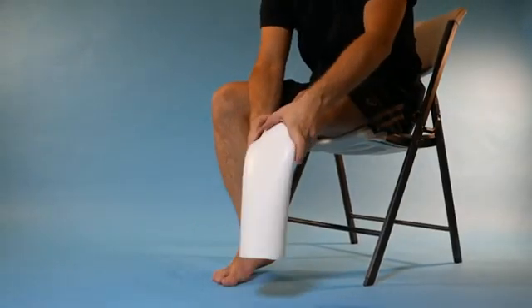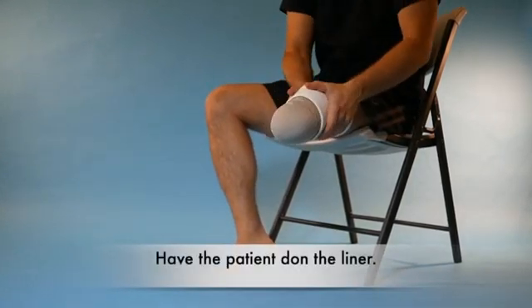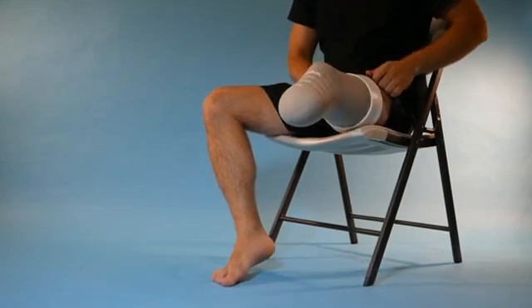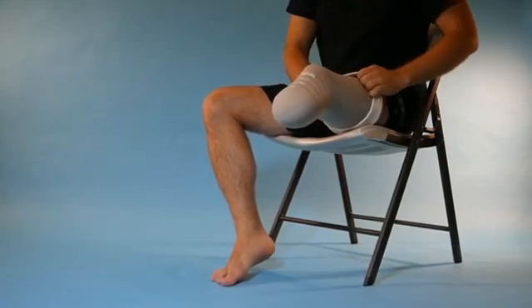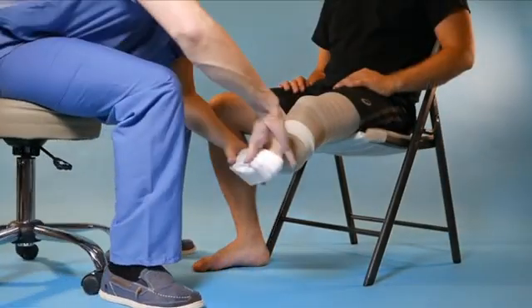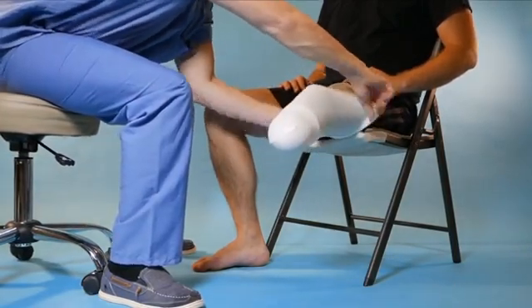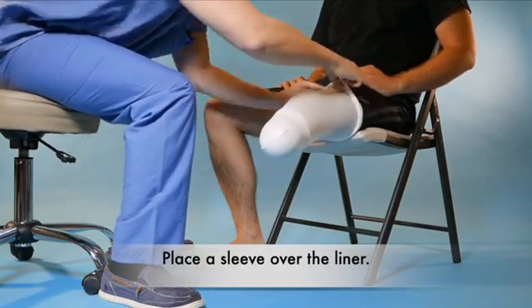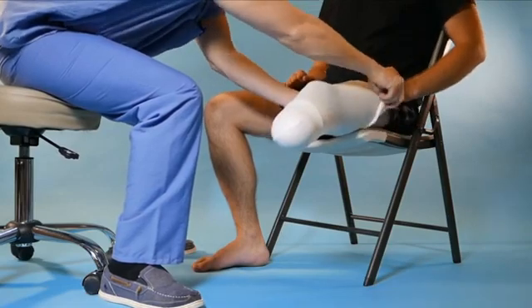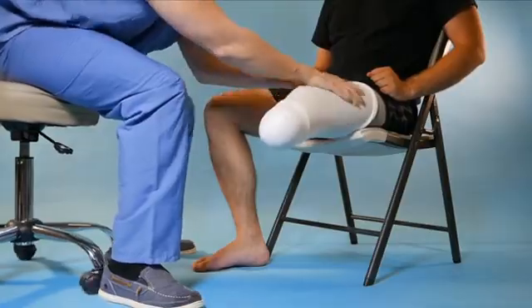Most PTB prostheses are constructed with a soft liner made up of polyethylene foam or silicone gel that acts as an interface between the residual limb and the hard socket. The liner absorbs some of the compressive and shear forces generated during ambulation, thus cushioning and protecting the stump. However, it may wear out over time and will have to be replaced.